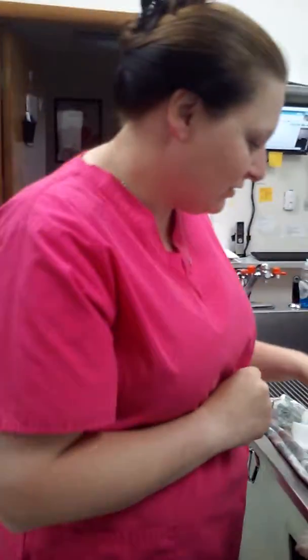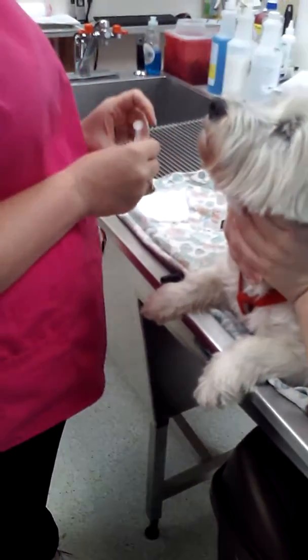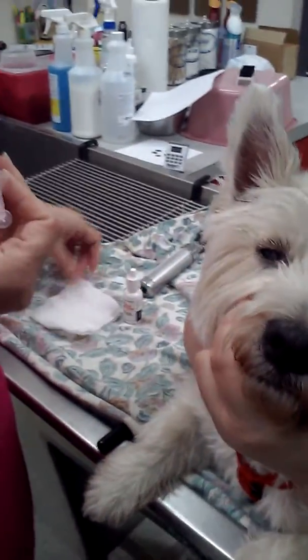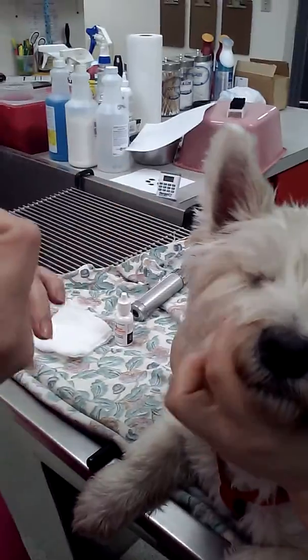We're going to do a fluorescein stain eye test. So we have our premix solution, we have our eye rinse, and our 4x4s.